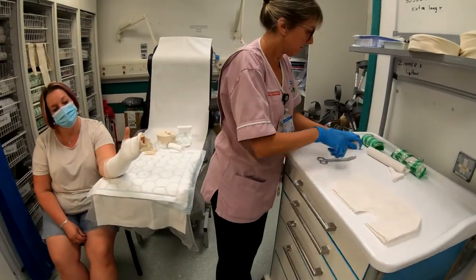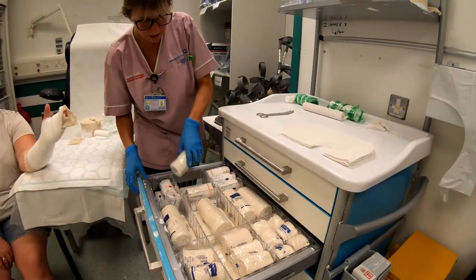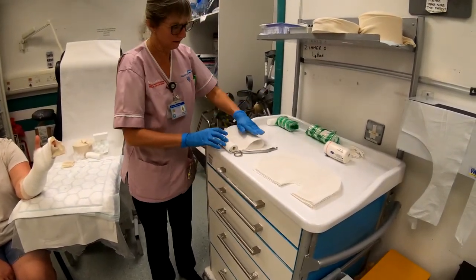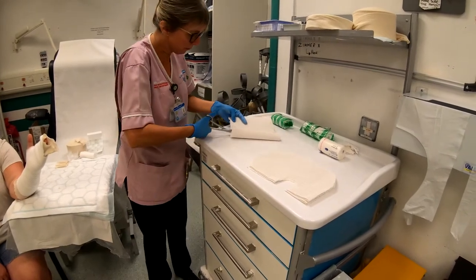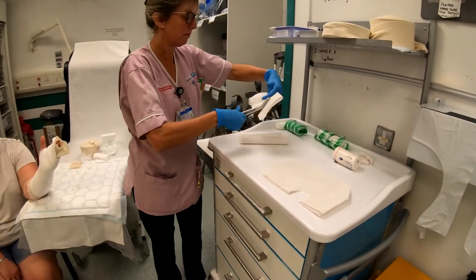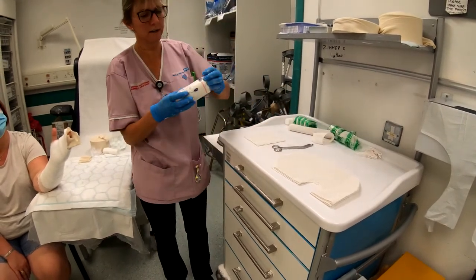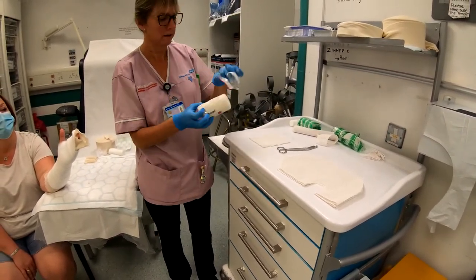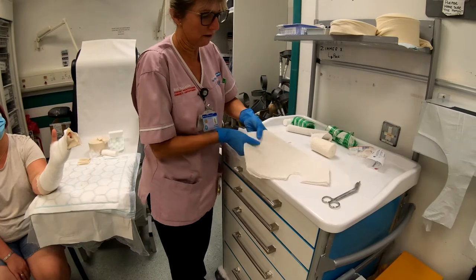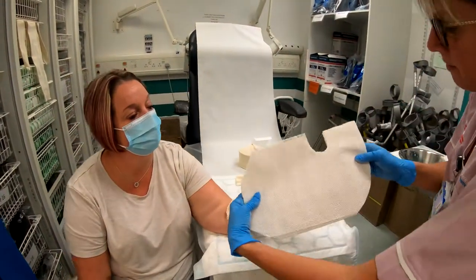Make sure we have a medium size bandage at the ready, and again we need our little securing slab to hold the bandage on. Have all your materials prepared before you wet the plaster so that you're ready to go. Open the bandage up fully so all materials are ready.